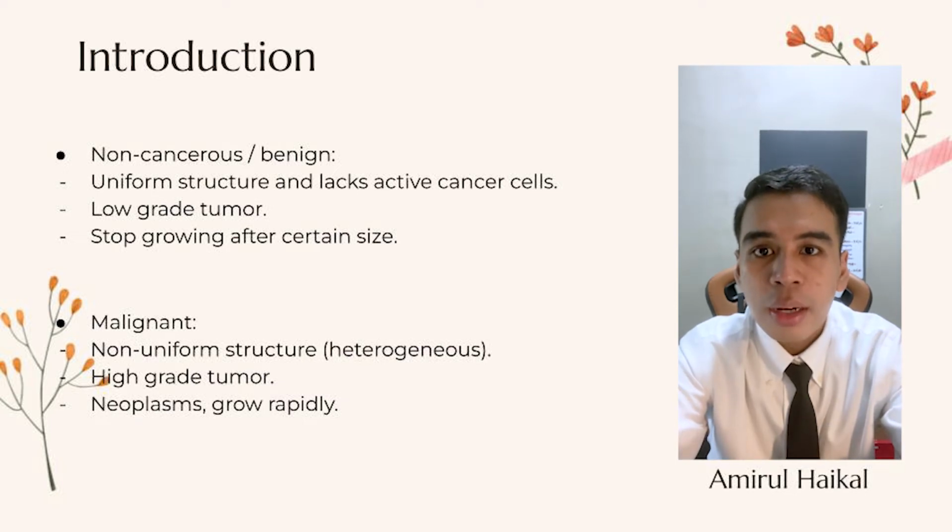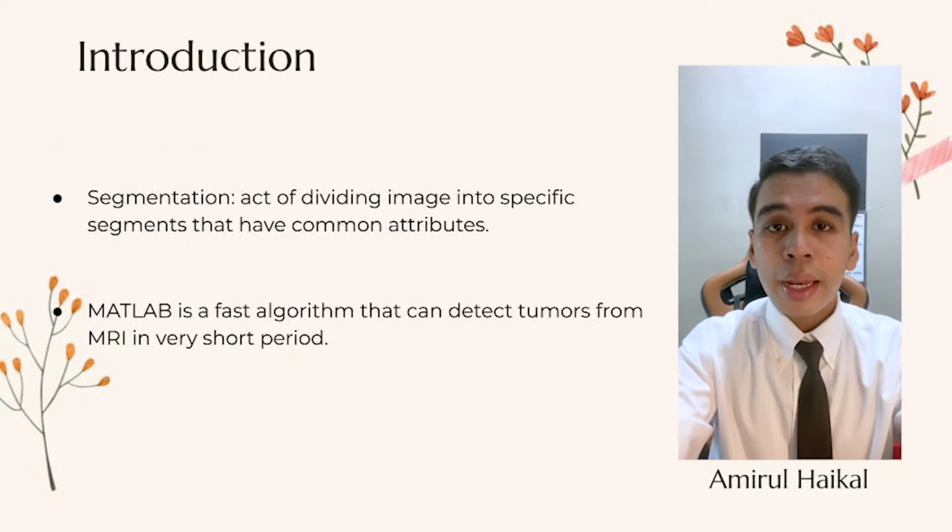Malignant tumors have a non-uniform, heterogeneous structure and contain active cancer cells. They are considered high-grade tumors. Malignant tumors, also known as neoplasms, grow rapidly, have an infinite lifespan, and become increasingly invasive. In medical imaging modalities, segmentation is used to detect diseased tumor tissues.